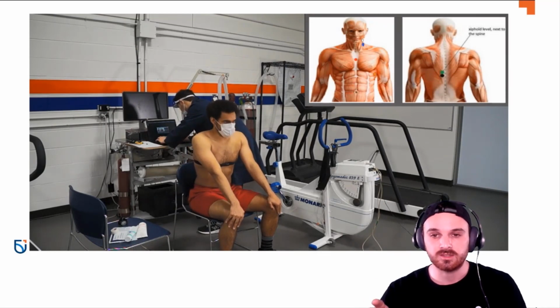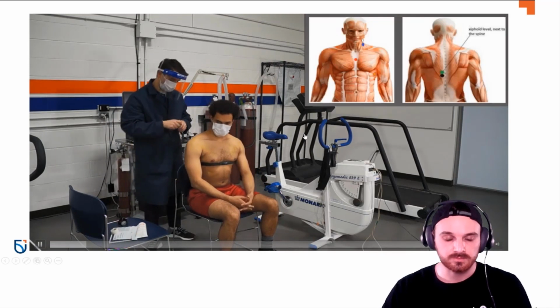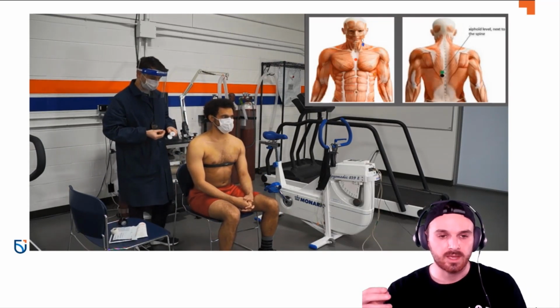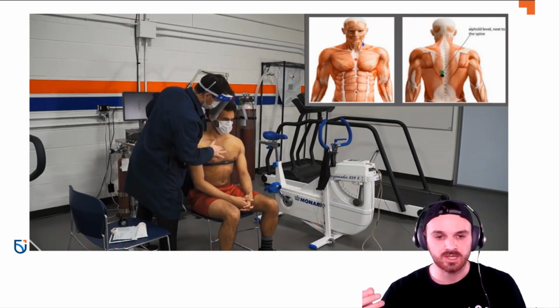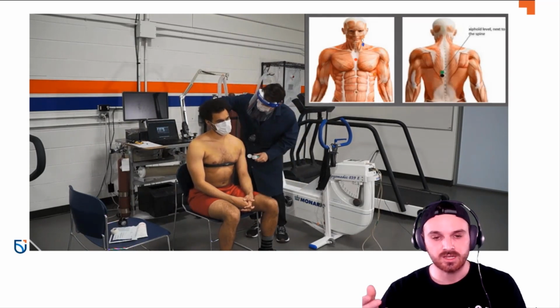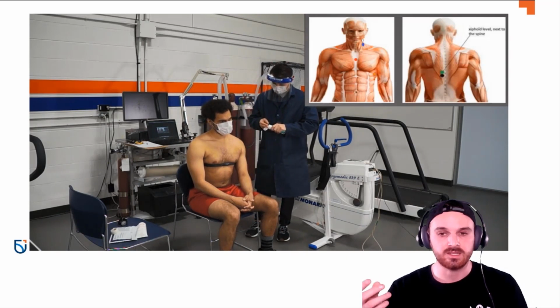So here is the little diagram. It actually pops up on screen, tells you where to put your electrodes. Right here I grab, I believe this is our new prep. This is just like an abrasive gel. So what this does is it reduces the input impedance of the skin, making it easier to conduct from the sort of wet gel electrodes into the skin.